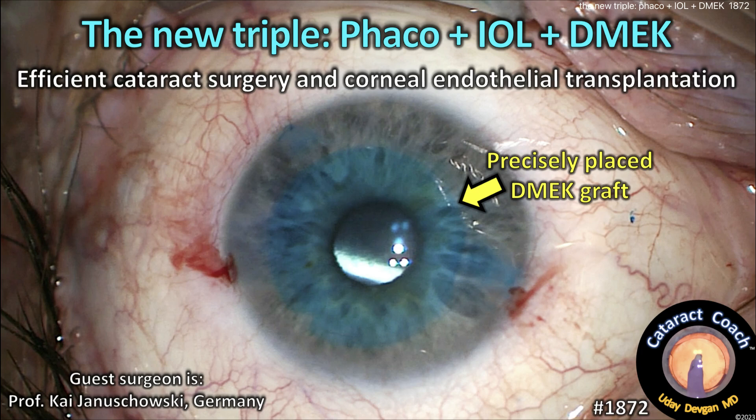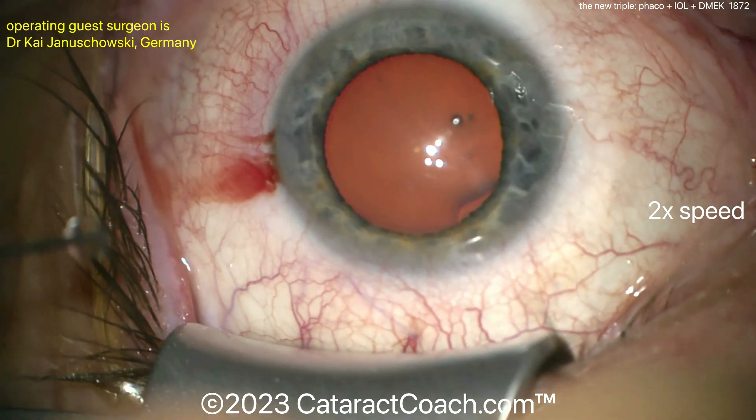CataractCoach.com. The new triple: FACO plus IOL plus DMEK. This is a very efficient cataract surgery and corneal endothelial transplantation here.